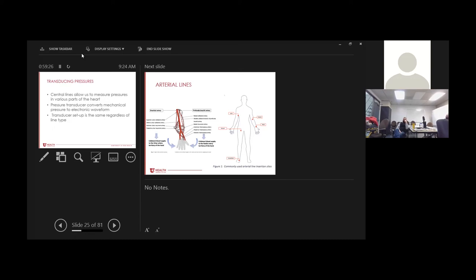If you're going to be doing it for pressor administration, and you're out of access, humeral IO is probably the preferred way, but every situation is different. That's not a rule. It's probably the most common practice. Is there a preference to go opposite the central line placement with the IO, or whatever you can get? It doesn't matter. There's a quasi-informal study on the humeral head IO and using it as a go-between. Without a central line, it was better than any peripheral line you could get, but a little bit worse than central. It's so awesome to see. They often will sometimes dissect down the subclavian. And it is really instant.